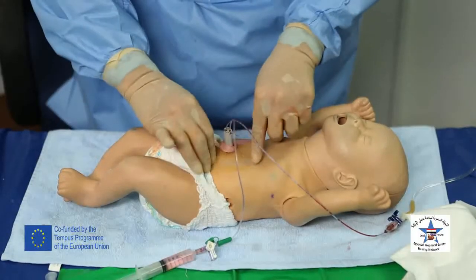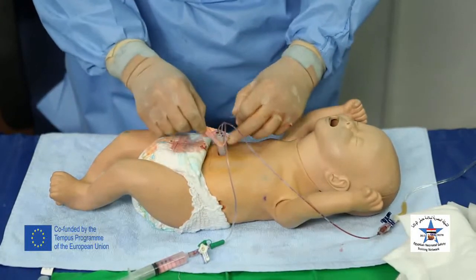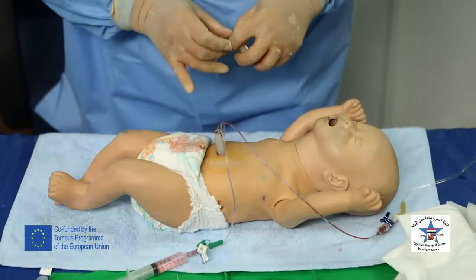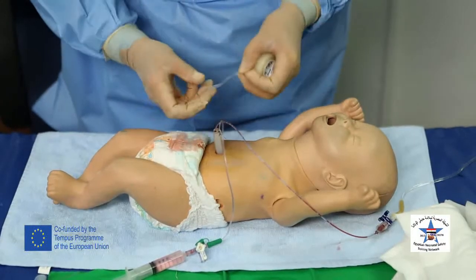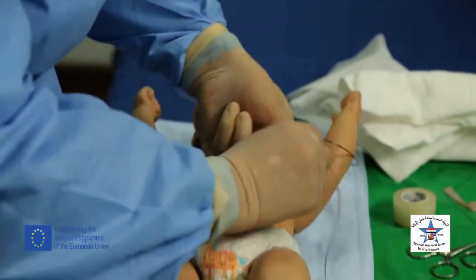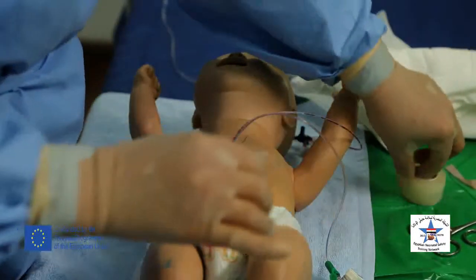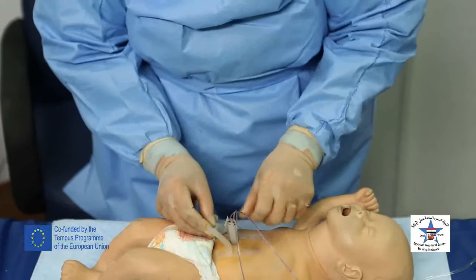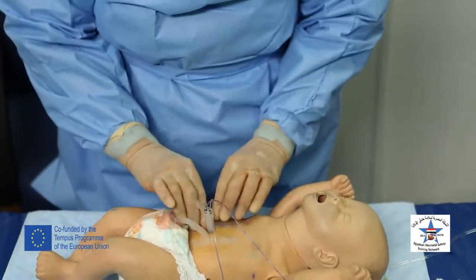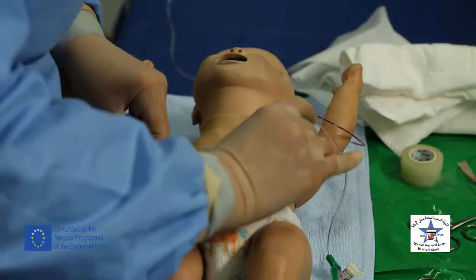For fixation of both catheters using the umbilical bridge, remove the umbilical tape. This way.